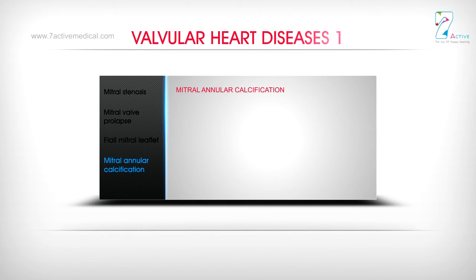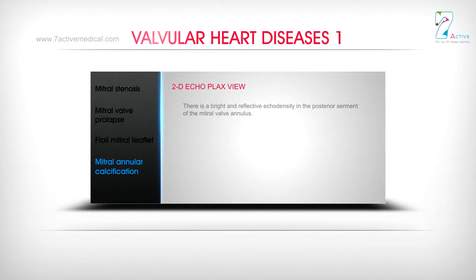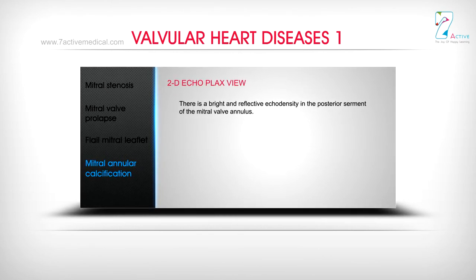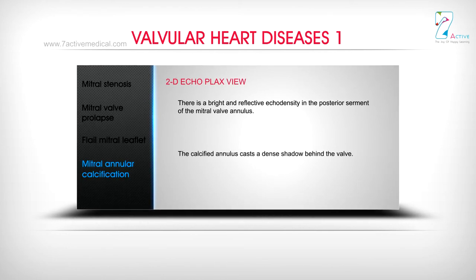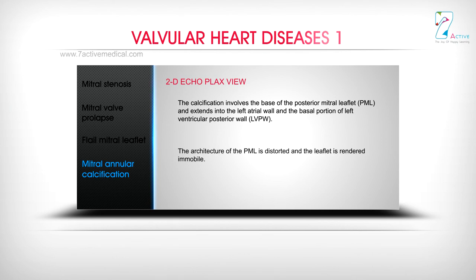Mitral Annular Calcification — 2D Echo PLAX View. There is a bright and reflective echo density in the posterior segment of the mitral valve annulus. The calcified annulus casts a dense shadow behind the valve. The calcification involves the base of the posterior mitral leaflet (PML) and extends into the left atrial wall and the basal portion of the ventricular posterior wall (LVPW).